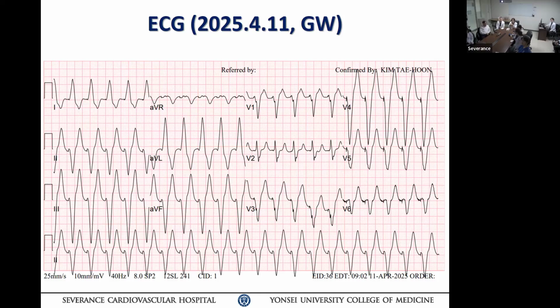So PMT, raise your hand. 1, 2, 3, 4, 5. Okay, 6 people. Then atrial arrhythmia, atrial fibrillation. 1, 2, 3, 4, 5. One person difference. 6 to 5. Yeah, PMT and 1. Mostly YB versus OB. Dr. Wang, you have a casting vote.